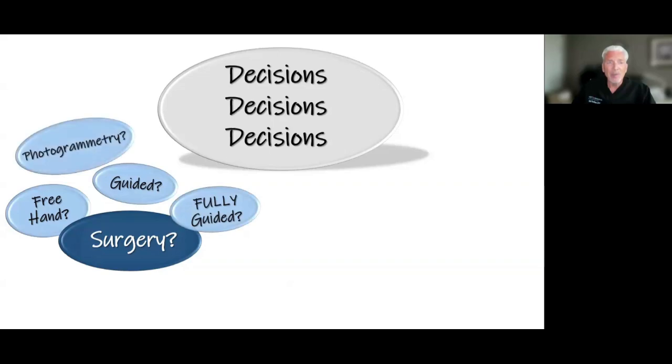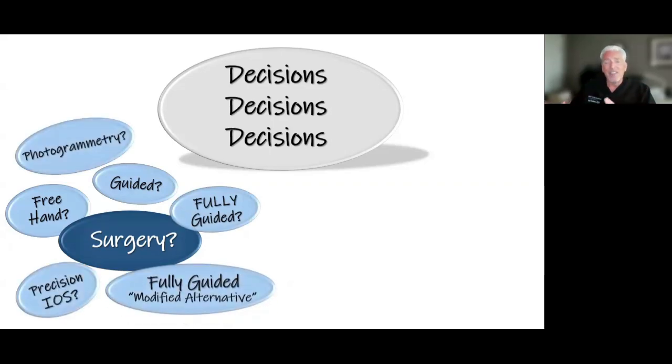But let's divide things up here. So surgery. There's a lot of things to think about nowadays with surgery. Are we looking at free-handed surgery? Do you want to do guided surgery, fully guided surgery? And what does that mean? Using precision IOS technologies, how are our intraoral scanners playing a role?